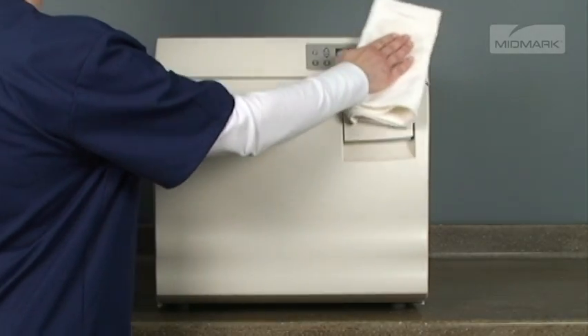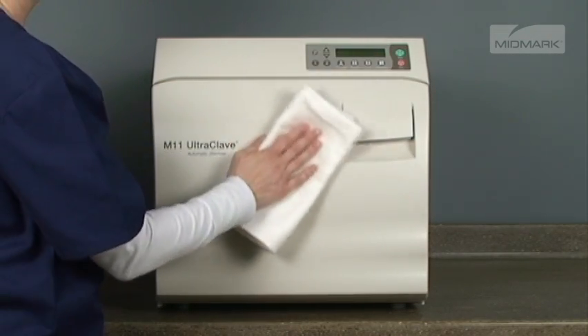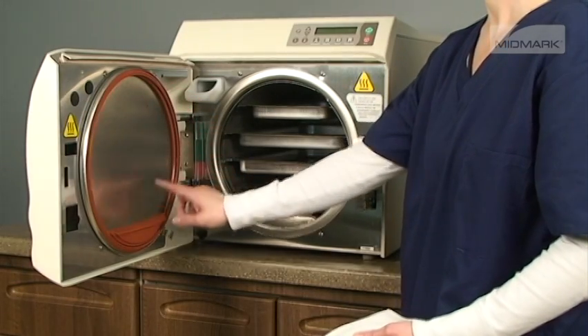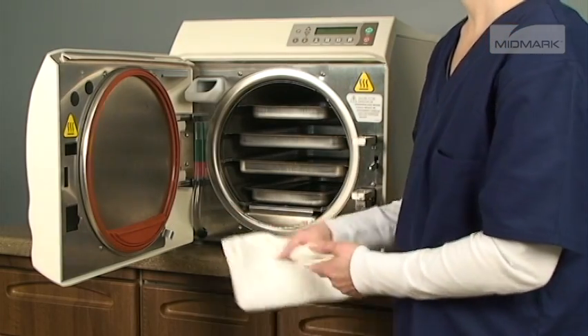The exterior of the autoclave should be wiped down each day. Use only quaternary disinfectants to disinfect the unit — do not use alcohol or bleach-based cleaners. The door gasket and door dam gasket should be inspected for damage. When the inspection is complete, wipe with a damp cloth.